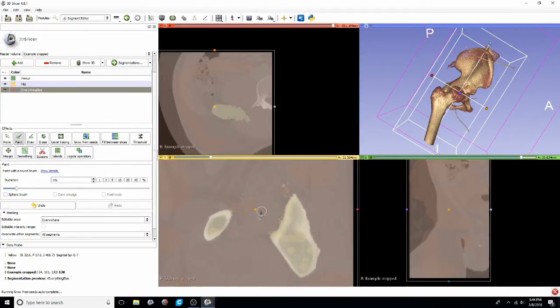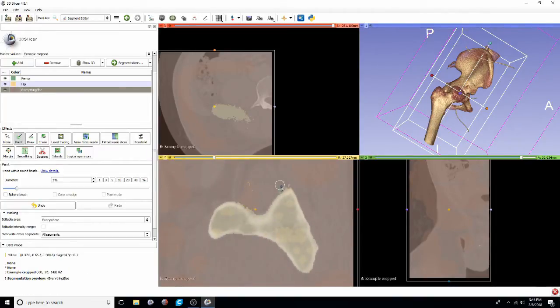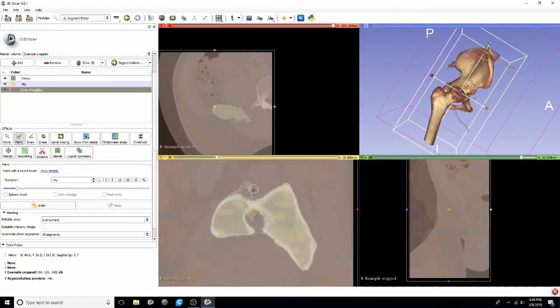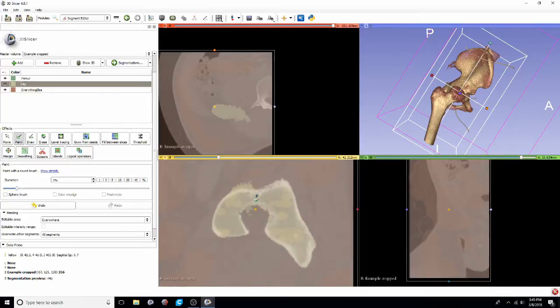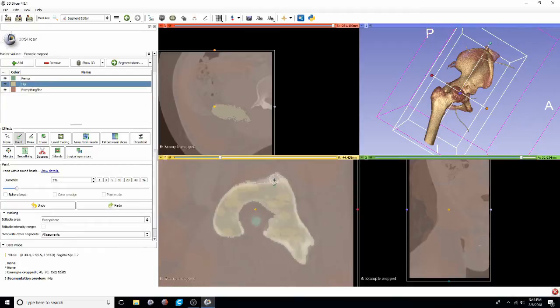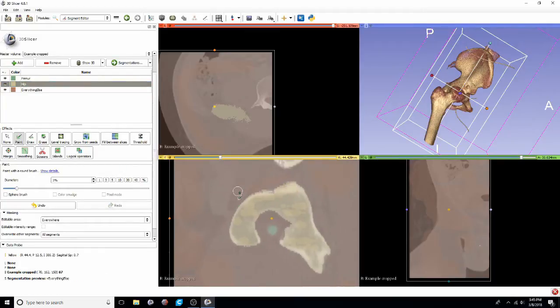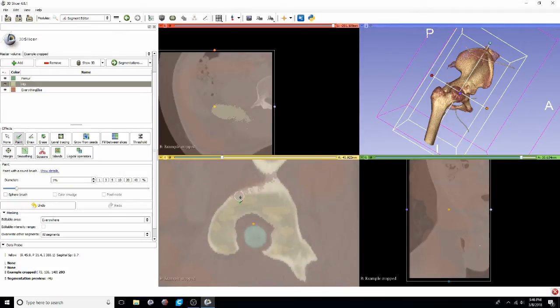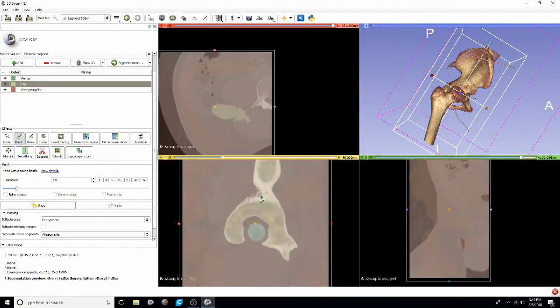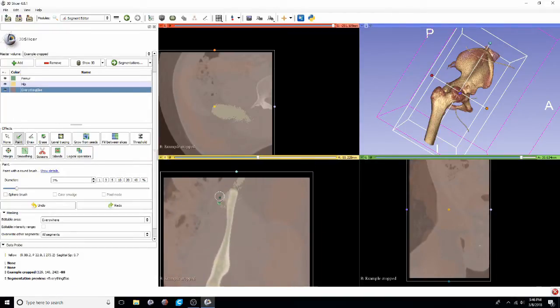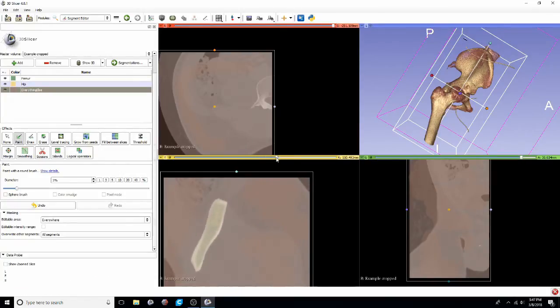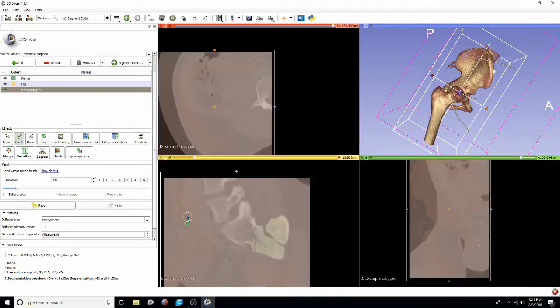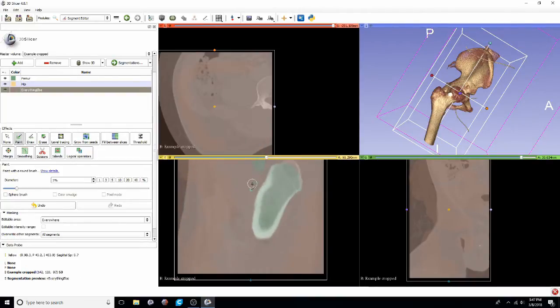It's a good idea to always use the three views. I find that certain views are better for things like when I'm working in between the femur and the acetabulum. But you always want to make sure that you're checking in on all three views because sometimes segmentation will look really good in one of the views. But then you'll switch to a different one and you'll find that it actually doesn't look quite as good in that view. So here I am scrolling through making sure that our yellow view looks good. It's looking pretty good so far.